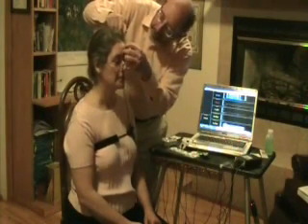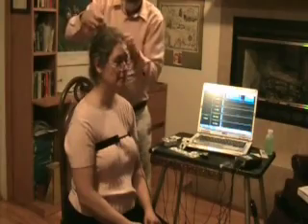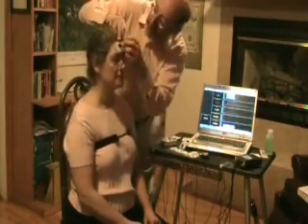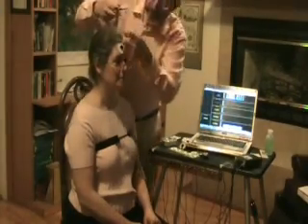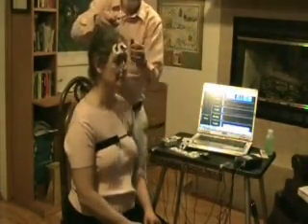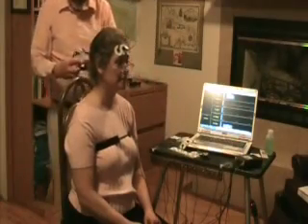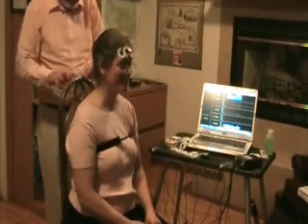So I'm putting each active sensor approximately midway the normal brow line and about midway over the eyes. Remember, we're not trying to pick up muscle tension itself, so it really doesn't matter that much where we put the sensors. So when we're done, don't suddenly get up because the sensor lead is taped to the chair.